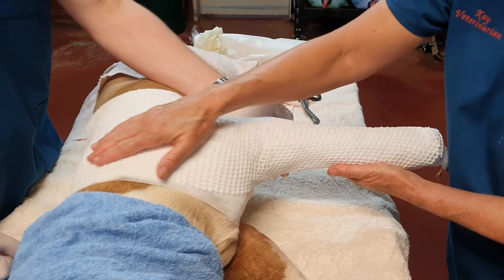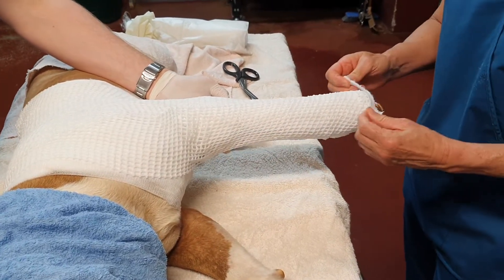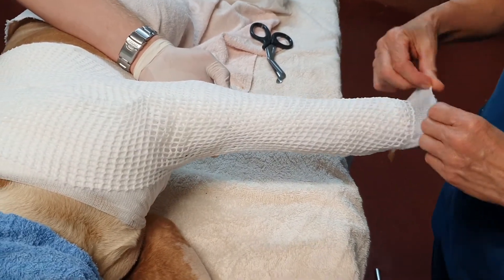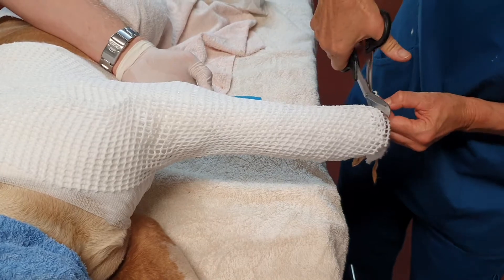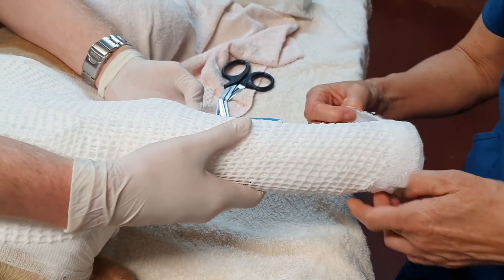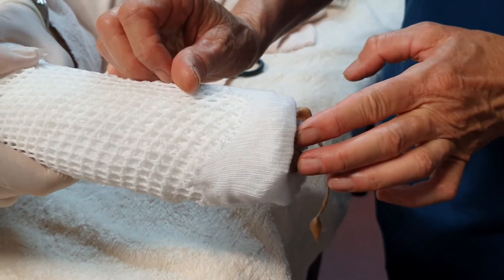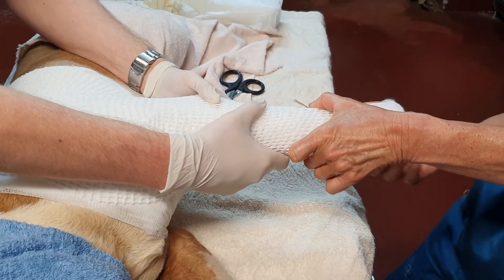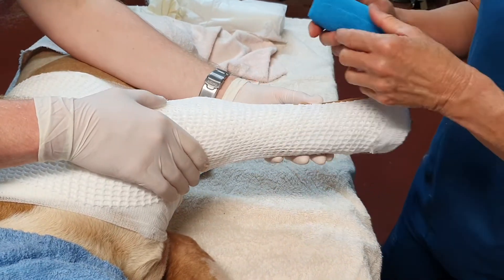We've just waited a little while until that has set. I have not gone over this layer with a conforming layer — I've done that manually while applying it. At this point we'll just roll up the tubinet at the bottom. I've made my cast a little bit too long so I can't roll the padding up over the top, so I'll just come in and cut the splint material just a little bit shorter, giving a nice rounded rolled edge to the distal aspect of the cast, which is less likely to cause rub marks on the toes. Just two of the middle toes are visible so we can monitor them for swelling. The stirrups get pulled up and stuck down firmly.